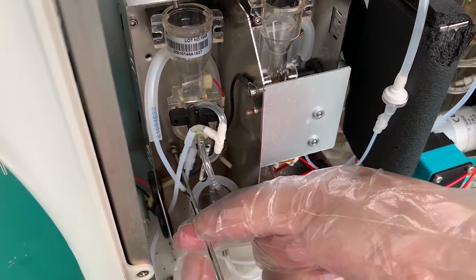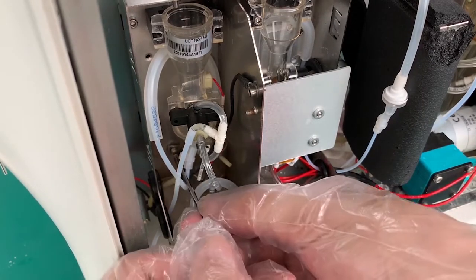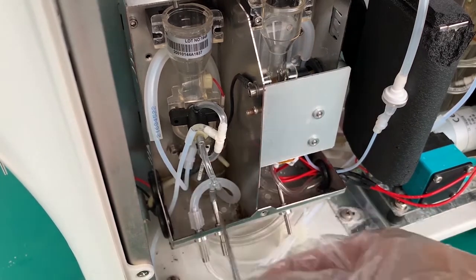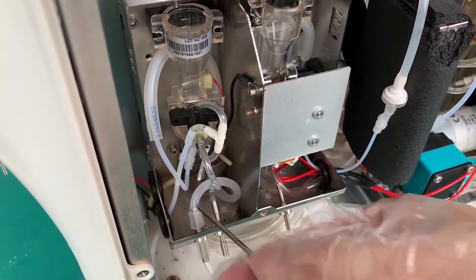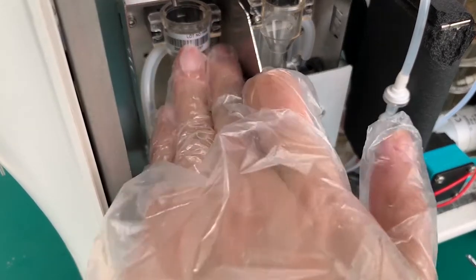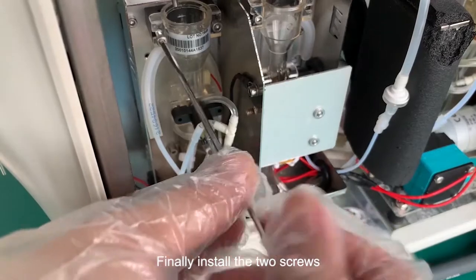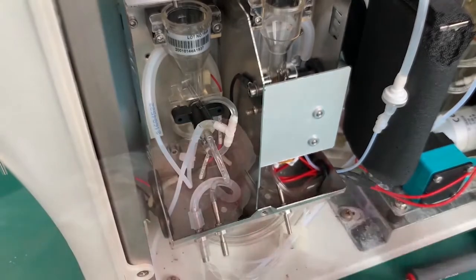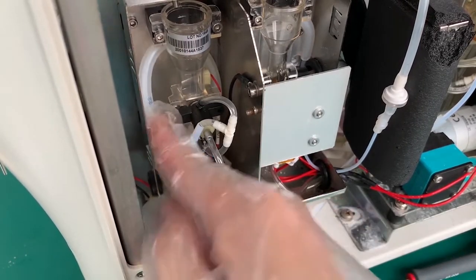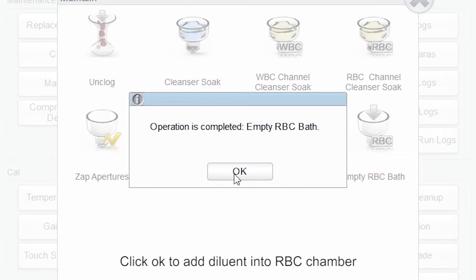Tighten the screw. Finally install the two screws. Make sure all the tubes cannot be folded or pressed. Click OK to add diluent into the RBC chamber.